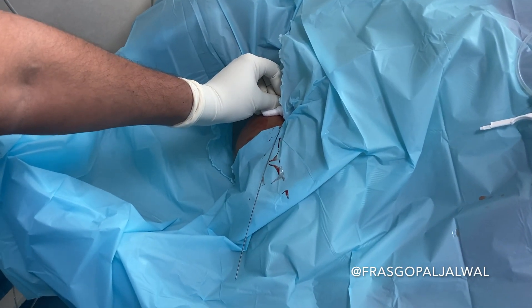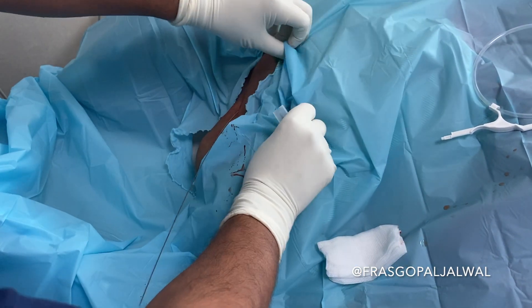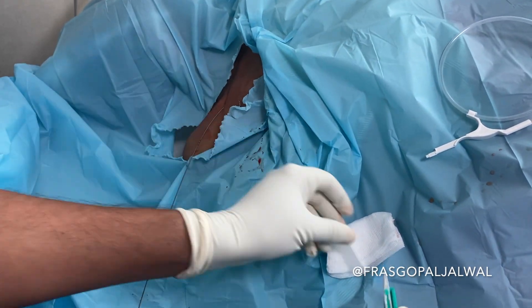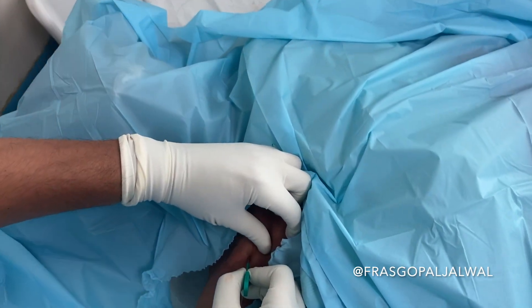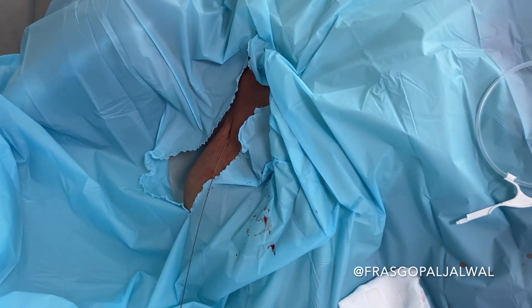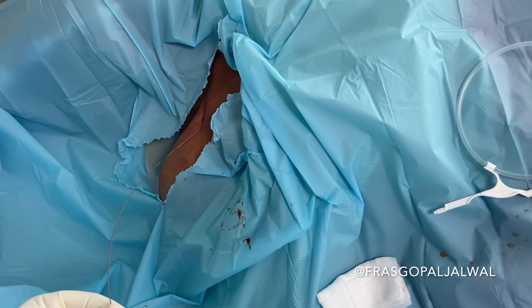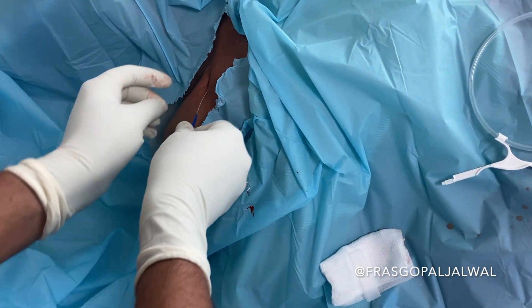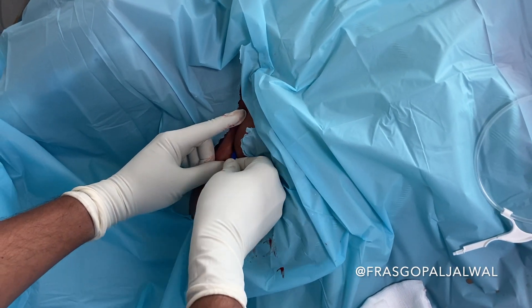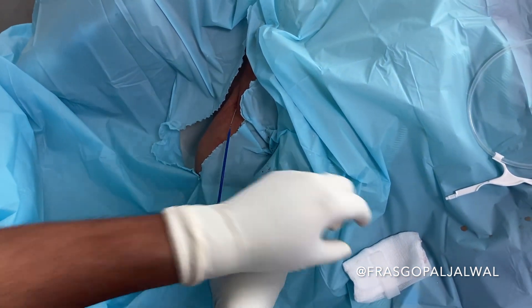The next step is to make a small, superficial nick at the insertion site of the guide wire. Then railroad the dilator over the guide wire to dilate the skin, inserting the dilator at least 3 to 4 centimeters.